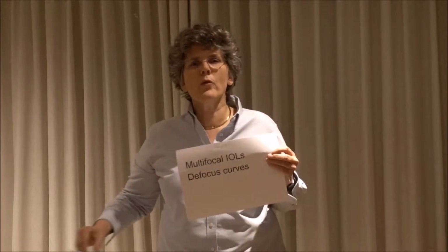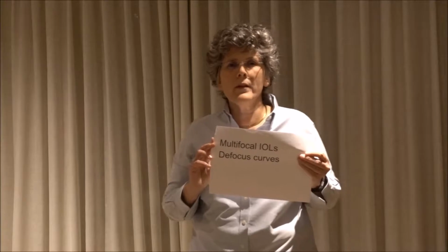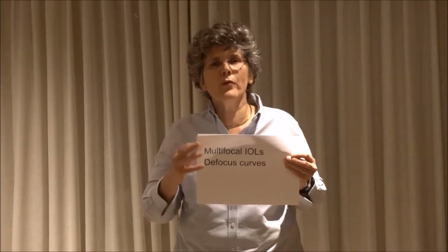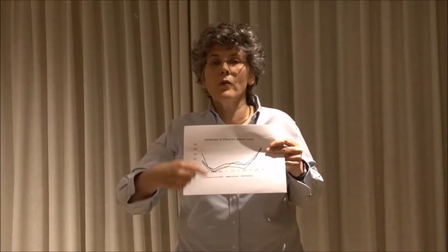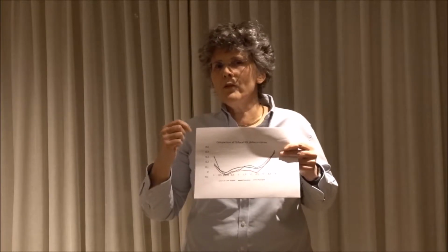When we have multifocal IOLs, we try to describe them in terms of vision far and near, and also in terms of contrast sensitivity and of defocus curve. Now, we all know that everyone can make a defocus curve for their multifocal IOLs, and the problem is that usually the scaling of the graphs are not the same, and also we know that they are most often not superimposed. So for us, the clinicians, it's very difficult to compare two different multifocal IOLs and two different defocus curves.